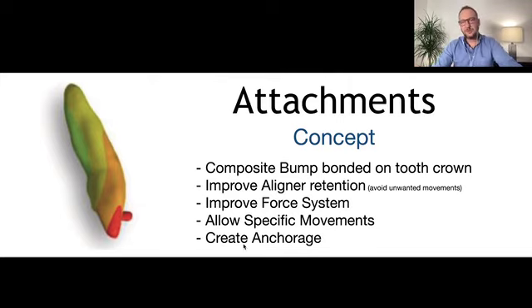Tracking is another word that I'm going to use a lot. It means kind of predictability. It means how much the teeth are moving according to what we have specified in the aligner, in the plastic, for each stage. So if for some stage we plan to do this and the tooth does exactly this, it means that we had 100% predictability. So we need to keep tracking the movements, and check if the aligner and the tooth are following what the aligner is saying, okay?